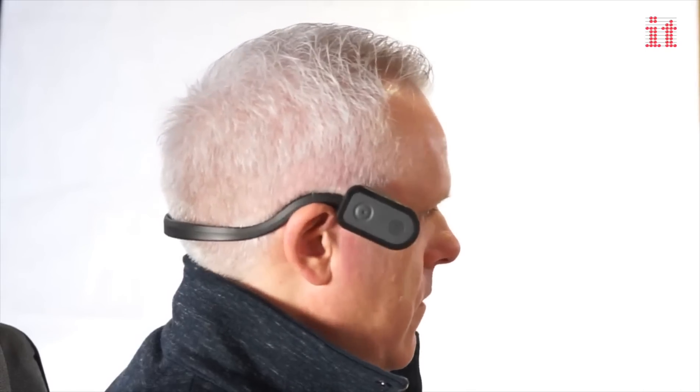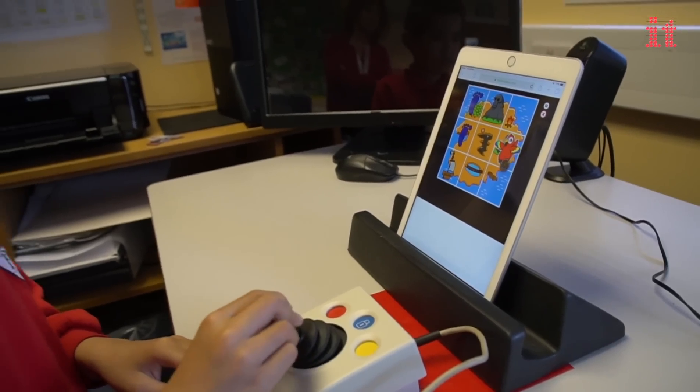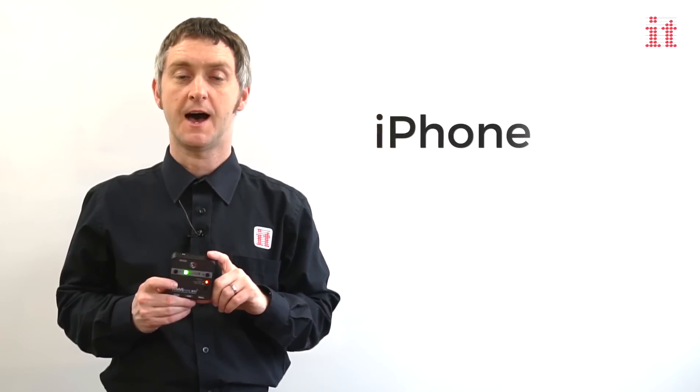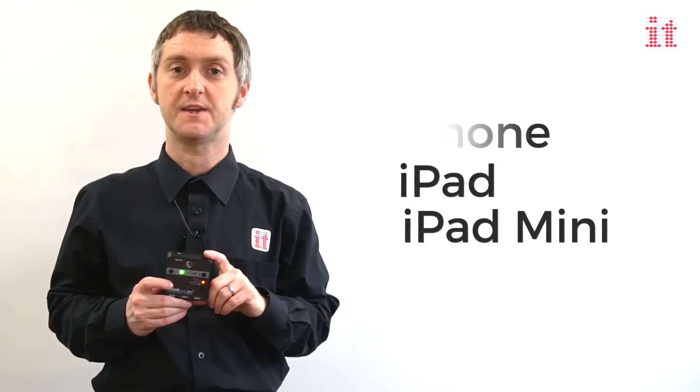This includes a head mouse, thumb mouse, trackball or joystick. The Aminao BTI works with iPhone, iPad and iPad mini, and connecting it couldn't be easier.